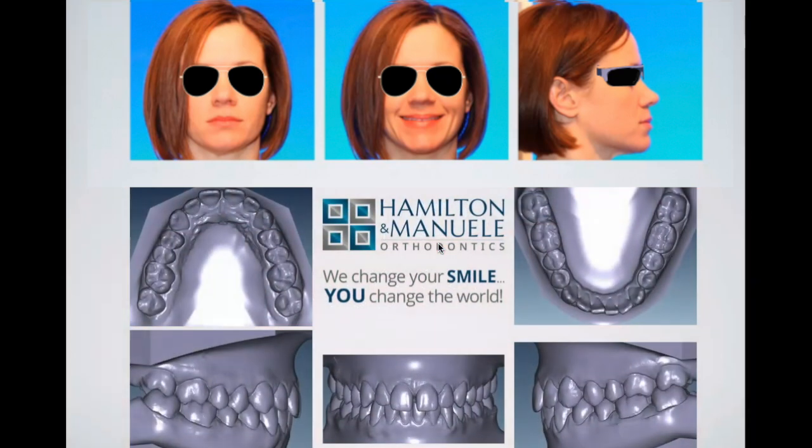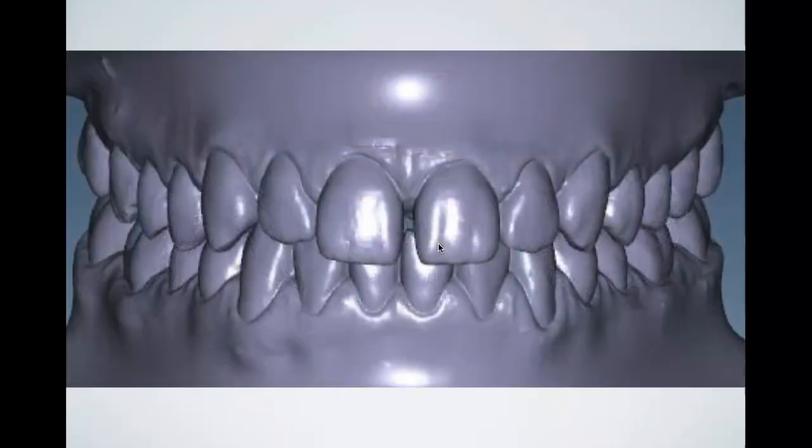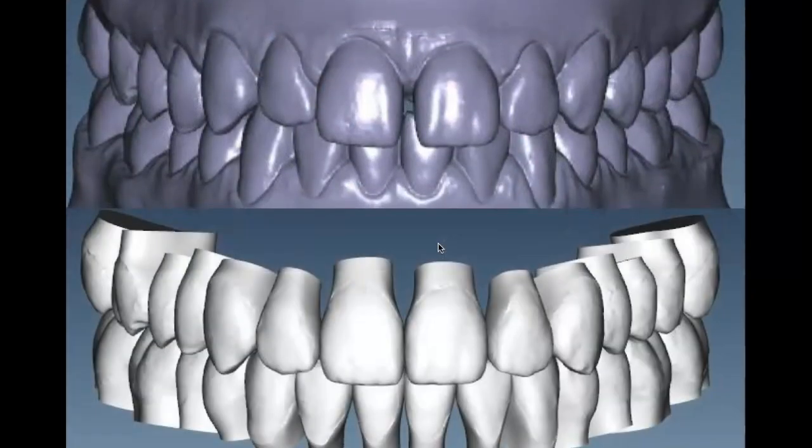But this was, at the time, Incognito, and I believe their processes are similar to how they are now. You take an intraoral scan, same idea. You section that out, and basically the lab will give you a setup. And again, at the time, they didn't have roots. I'm pretty sure they all have root integration now, which is nice. But you can see that they've set it up. They brought those incisors down a little bit.